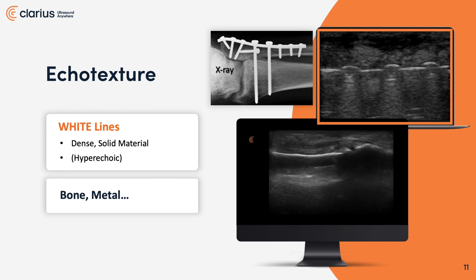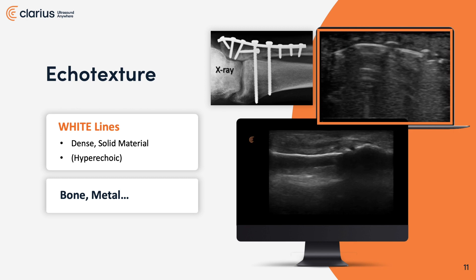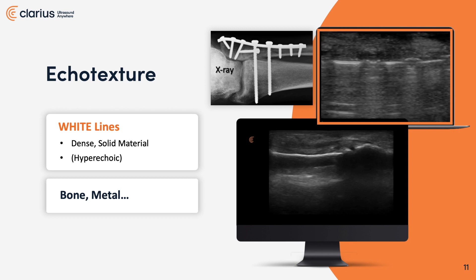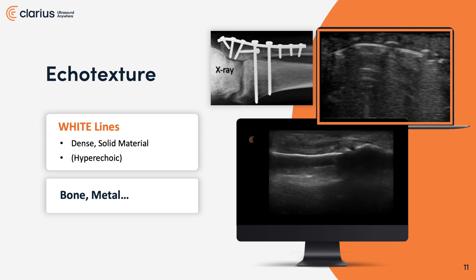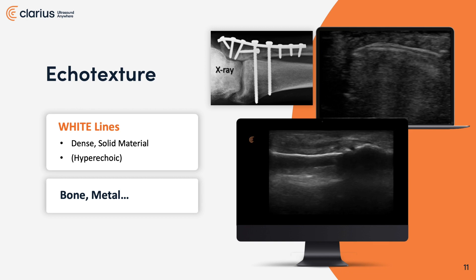If you look close at the x-ray, you'll see there are two screws a little higher up. That plate bends up and over the distal fibula. Watch as we take a look at that travel underneath the probe: here are the three screws, you see the two high screws, that plate goes up and over and stops at the bottom of the fibula. Anything below that you really can't tell because the density of metal stops the signal. But what I want to show you is that metal — and below here bone — has an echo return that's very, very strong. It's like shouting at a solid rock wall; you'll hear your echo back very clearly.